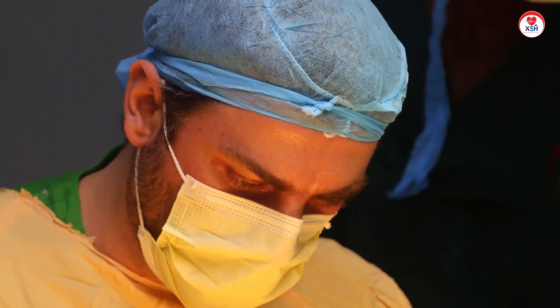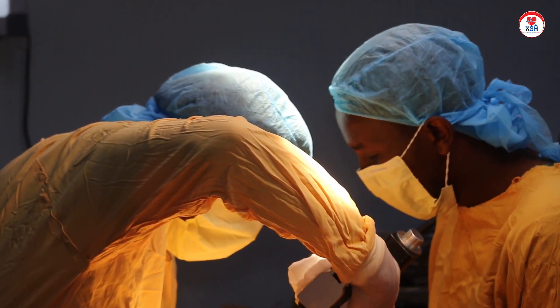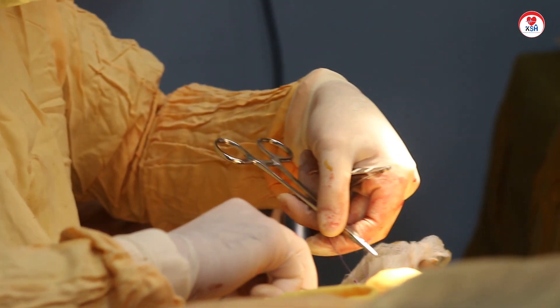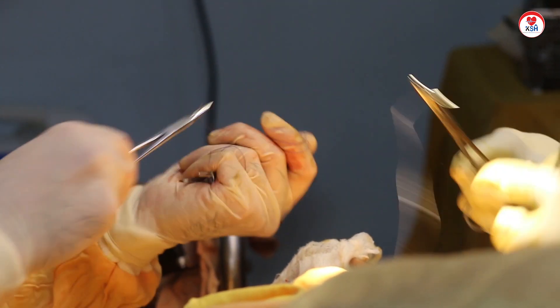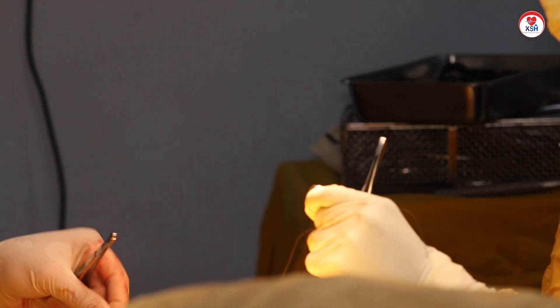The fracture site in the other part of the forearm is also described, and we can see the extension toward the wrist joint, along with the old fracture and its impact on the wrist joint.